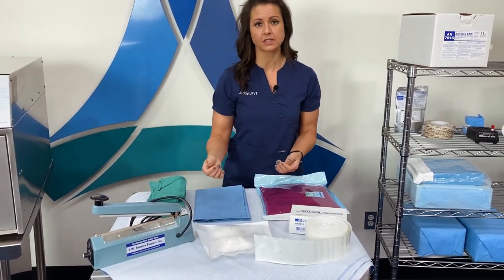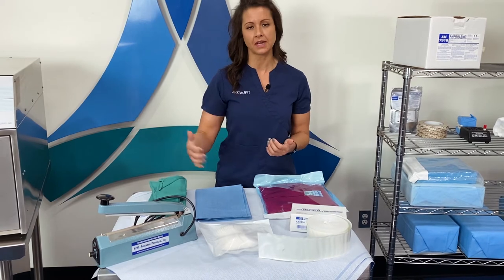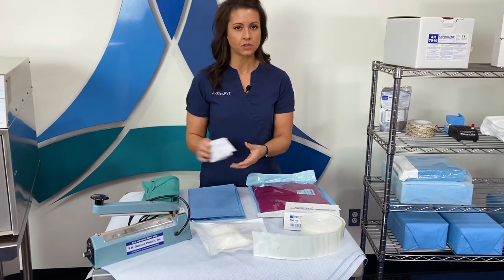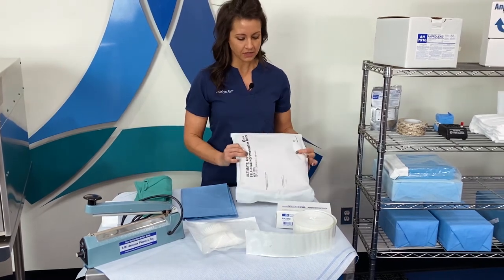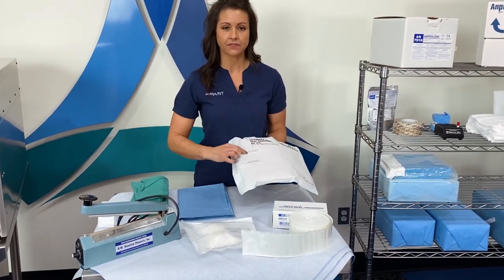Certainly follow your hospital protocols on how often you're rotating those out. You can use the indicators on the inside of these pouches. Also consider the self-seal pouches — they have color-change indicators on the outside of the packs relative to EO gas versus steam sterilization.